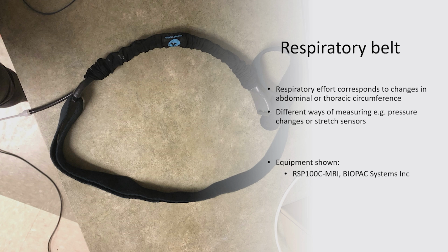A lot of times, especially if we have somebody that we're maybe not getting a good reading on, we'll put the belt on them while they're outside of the scanner, start our system, check the signal a little bit, and make sure that we're seeing the responses that we want to see before we send them back. There are different ways that these belts can capture the respiratory changes, like Meryl said, so I won't go into that in too much detail, but typically it's either a pressure change or stretch sensors.